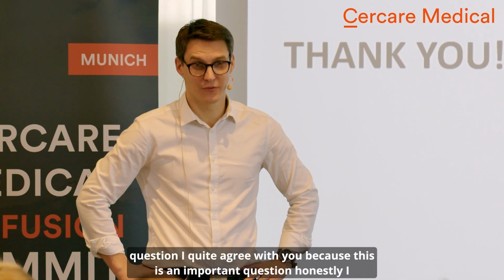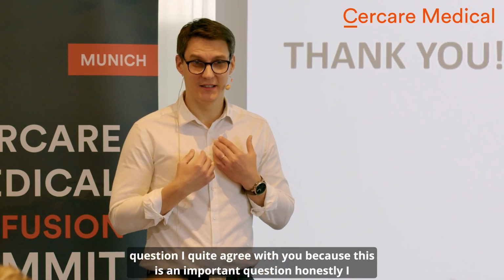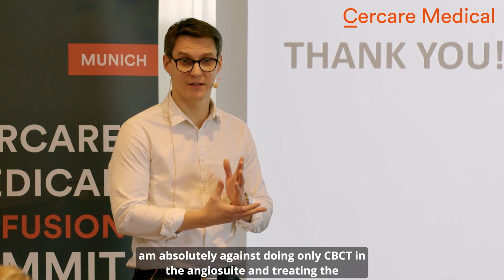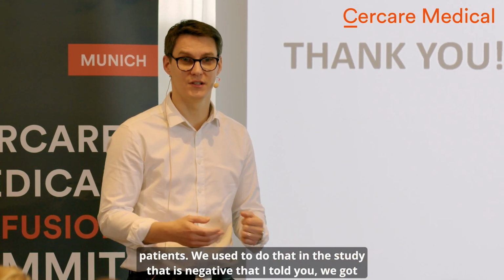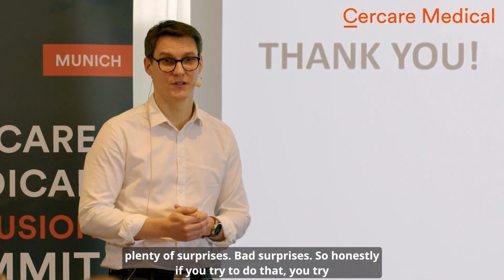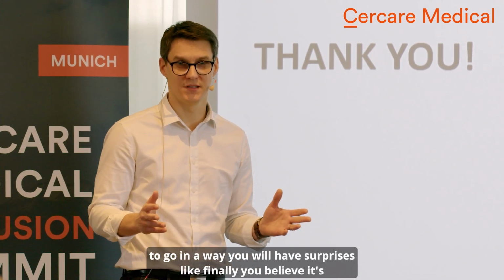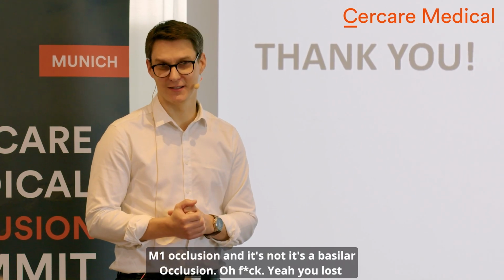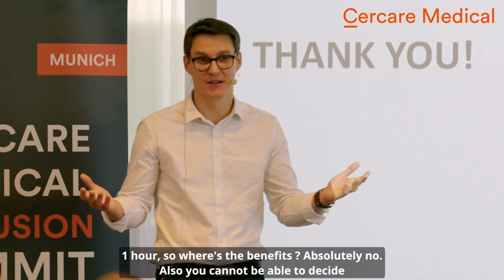Thanks for your question. I quite agree with you because this is an important question. Honestly, I am absolutely against doing only CBCT in the angio suite and treating the patients. We used to do that in the study that is negative that I told you. We got plenty of surprises, bad surprises. So honestly, if you try to do that, you will have surprises. Like finally you believe it's an M1 occlusion and it's not, it's a basilar occlusion. Oh, you lost 1 hour. So where's the benefit? Absolutely none.